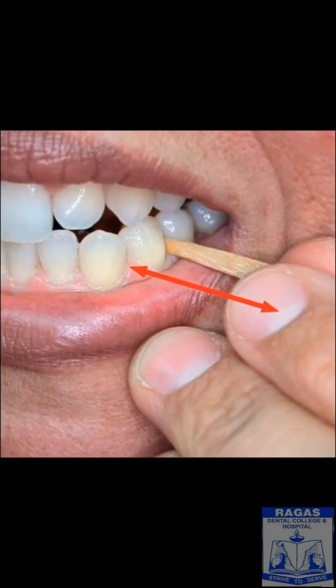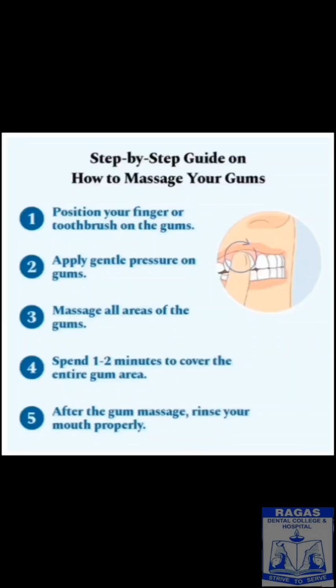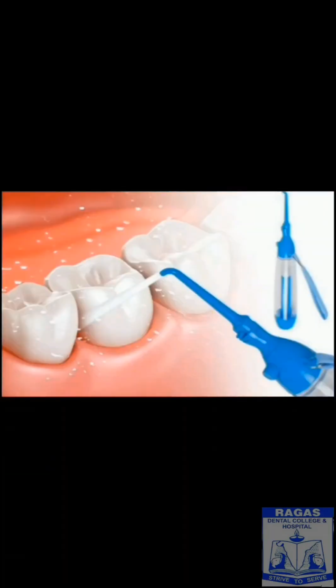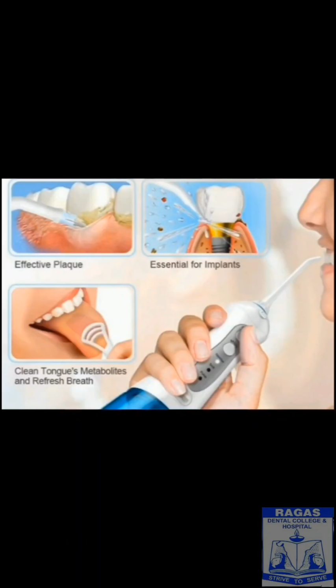So other aids which generally involve the gingival massage. The gingival massage is performed with either the toothbrush or the rubber tip stimulator or interdental cleaning devices. The oral irrigation devices are of several types. One can use a water faucet to irrigate between and around the teeth. The water pressure is steady and it is controlled by turning the faucet handle. Others use the intermittent water jet.